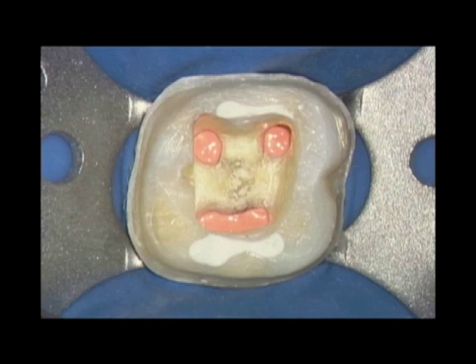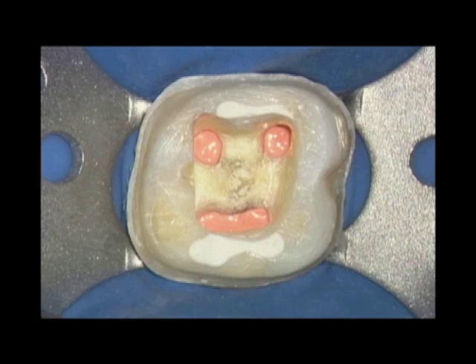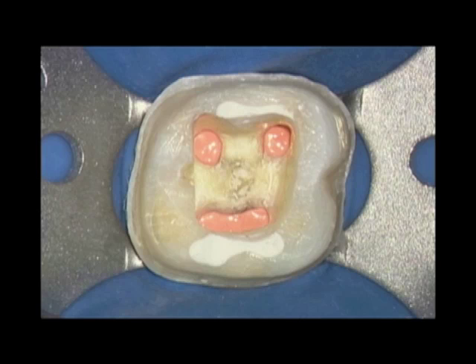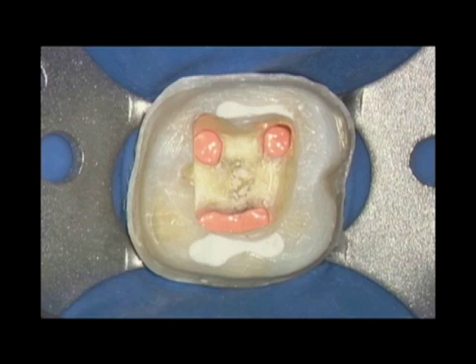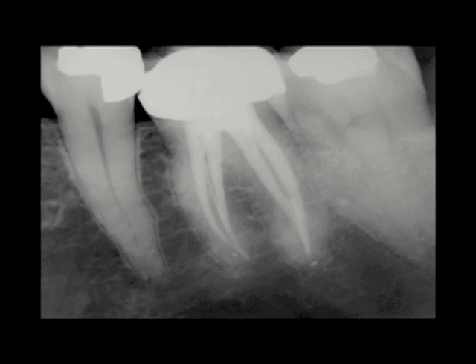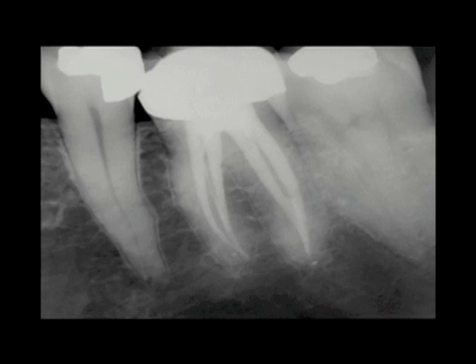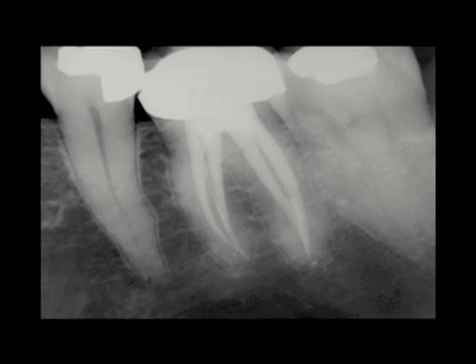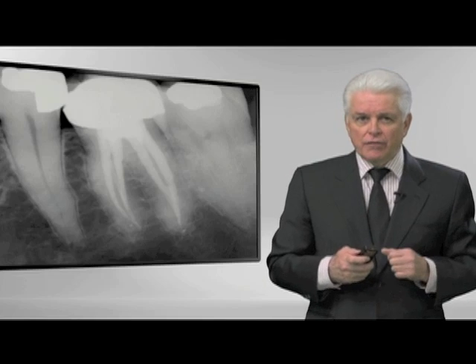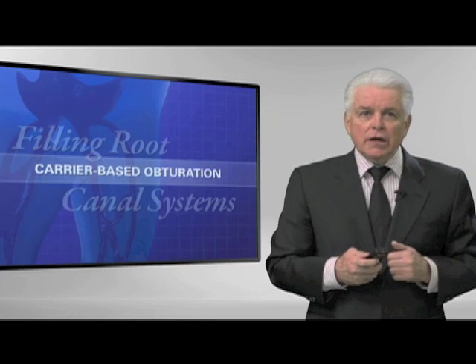You clean up the pulp chamber and at this point I would rely heavily on my dear friends, the general dentist who set the table. We'd want to send this case back to them in a way that makes it easy to manage the rest of the seal — the coronal restorative, as my friend Denny Southerd says. This is a very simple pack — an example of the classic Schilder, down-packing to within about five millimeters of the terminus, then backpacking, managing the coronal seal.